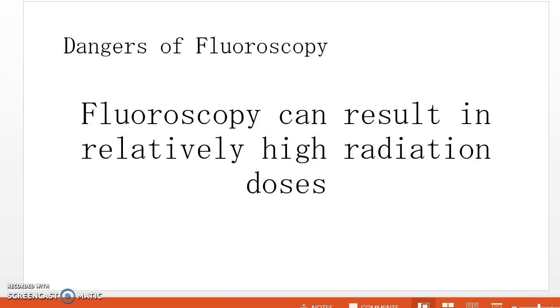So instead of standing behind a wall like for a normal X-ray, the technologist will normally be in the room, but will be in a full lead shield to help protect against radiation, as well as the radiologist and the patient, if it's possible.